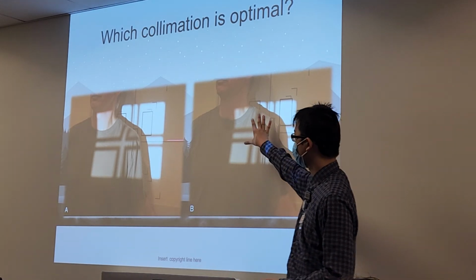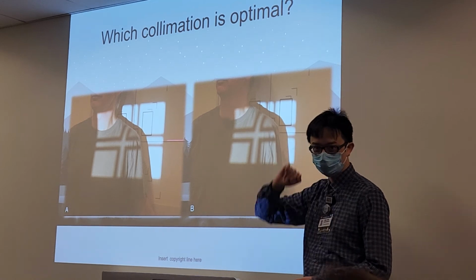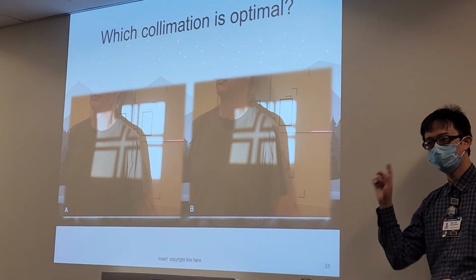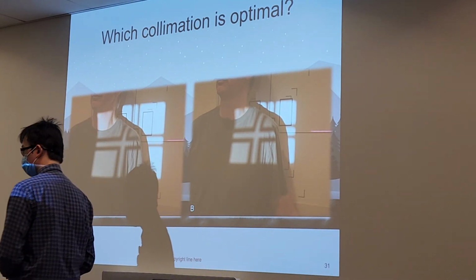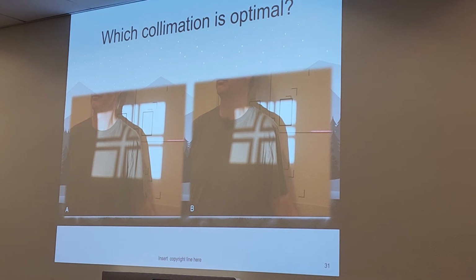In this case, for the shoulder, you see your crosshair right here? This crosshair is centered at a portion of the shoulder called the coracoid process, specifically 1 inch below the coracoid process. By doing so, you will be able to demonstrate the scapula, the distal portion of the clavicle, and the proximal humerus.